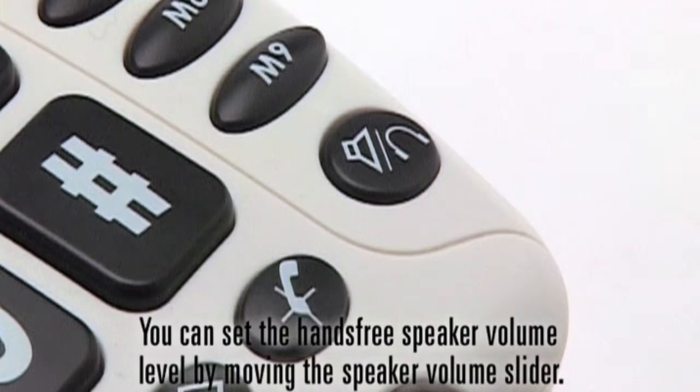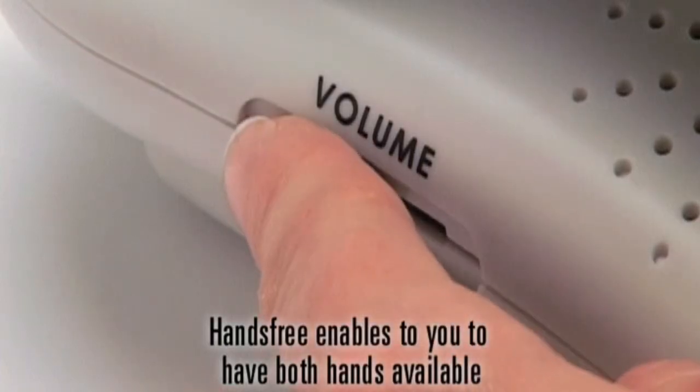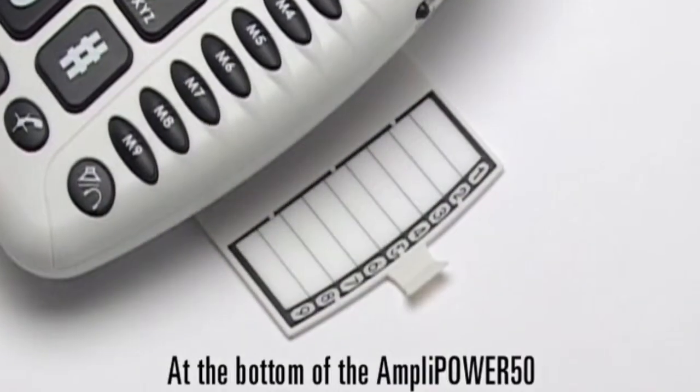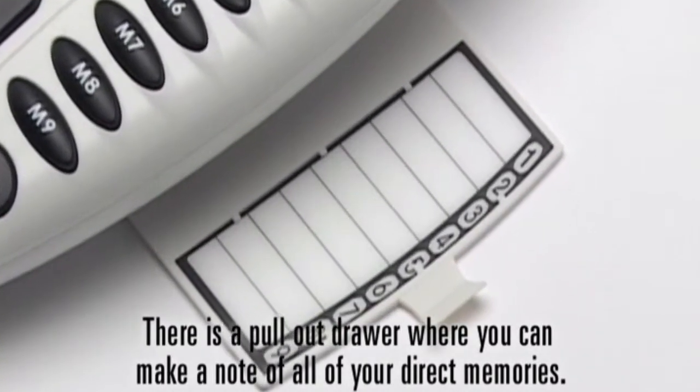You can set the hands-free speaker volume level by moving the speaker volume slider. Hands-free enables you to have both hands available as you don't have to hold the receiver to your ear. At the bottom of the AmpliPower 50 there is a pull-out drawer where you can make a note of all your direct memories.